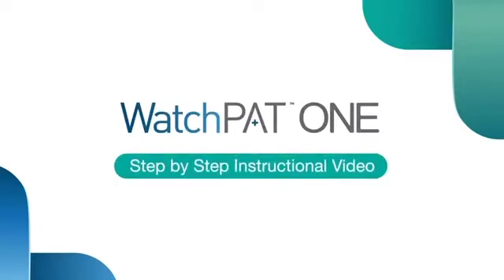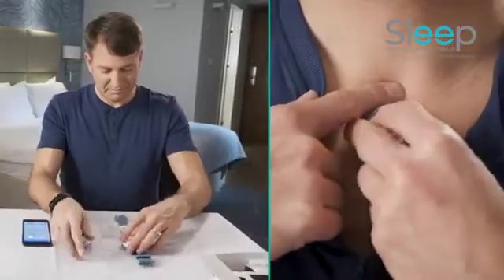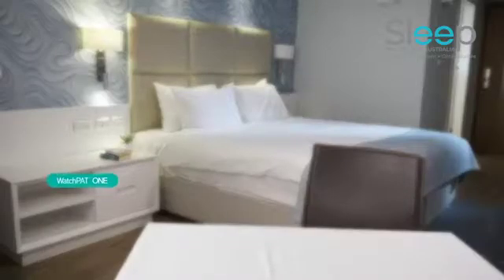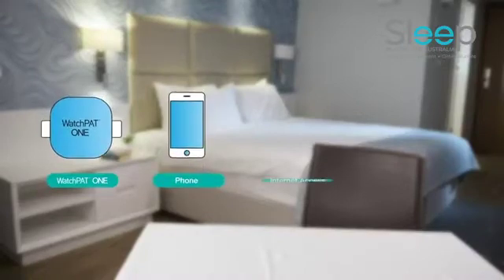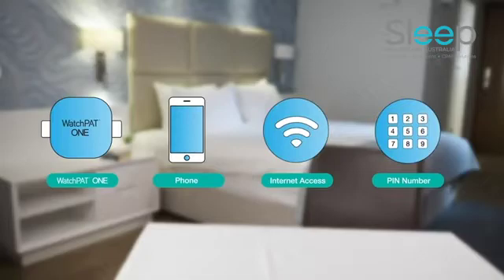Welcome to the Watchpat 1 instructional video. This video will guide you step-by-step through the correct use of the device. Please make sure you have your Watchpat 1, your phone, internet access, and a PIN number provided from your physician's office before you begin setting up your Watchpat.